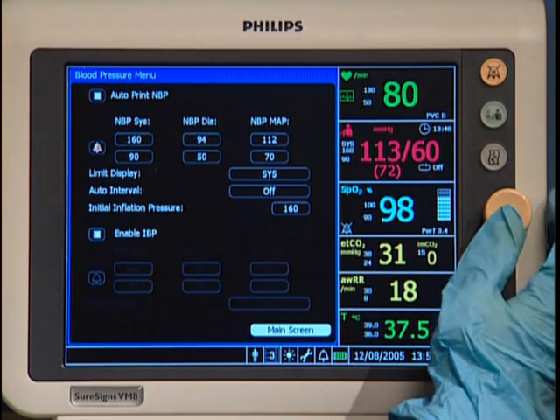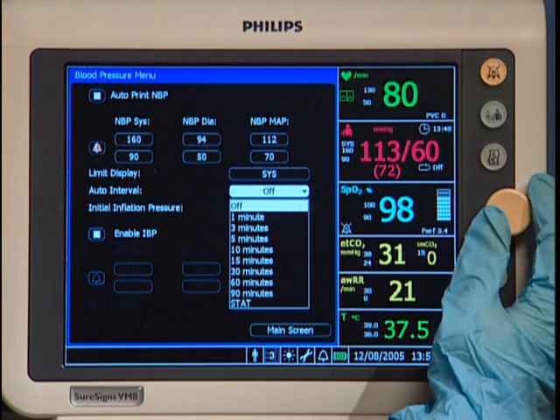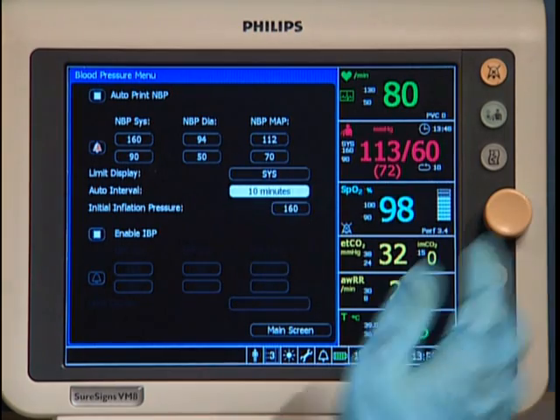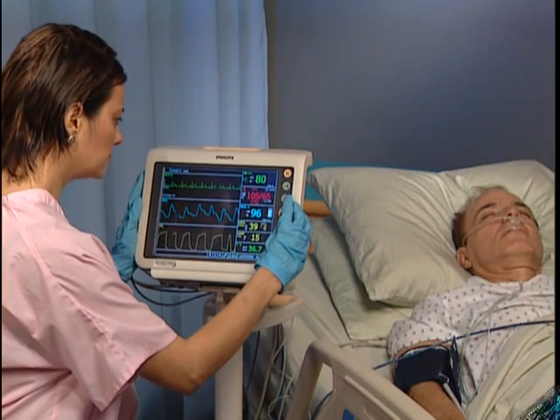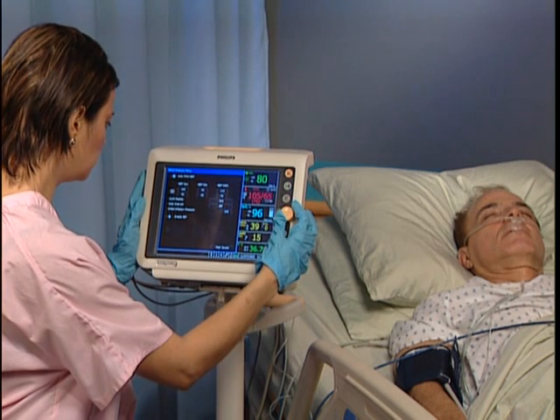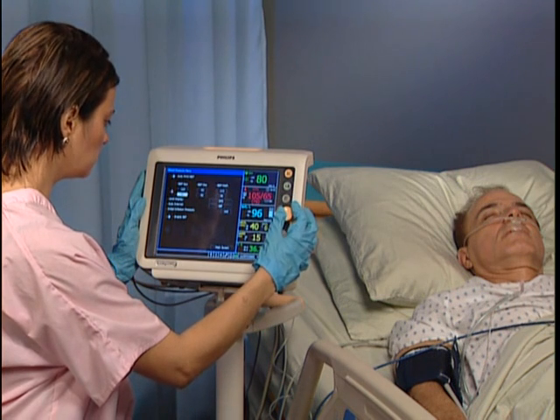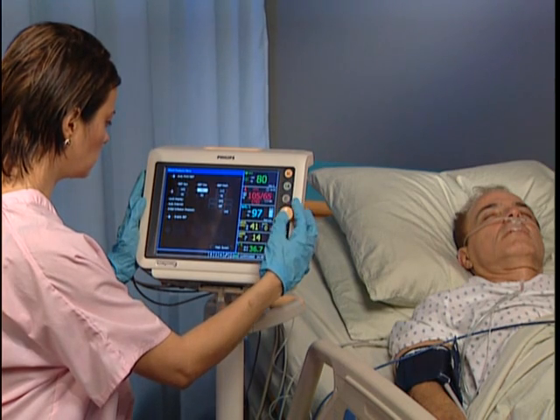Press the wheel and a menu associated with the highlighted area opens. In an open menu, you can change settings by highlighting an item and then pressing the wheel. Turn the wheel to change a setting and press the wheel again to select it. Using these same steps, you can make changes to any of your measured parameters, including alarm high and low settings, waveform settings such as assigning a different waveform to the current location, and menu settings such as screen brightness or patient type.